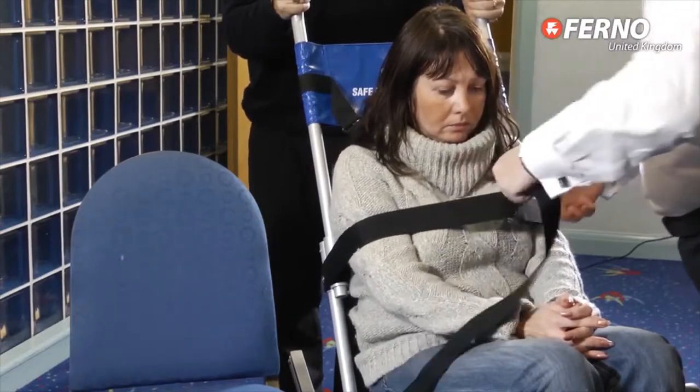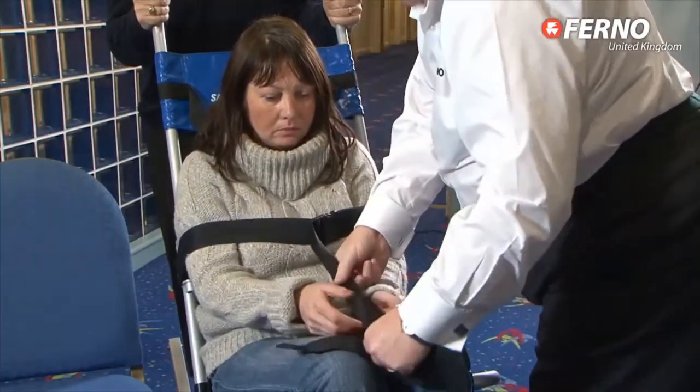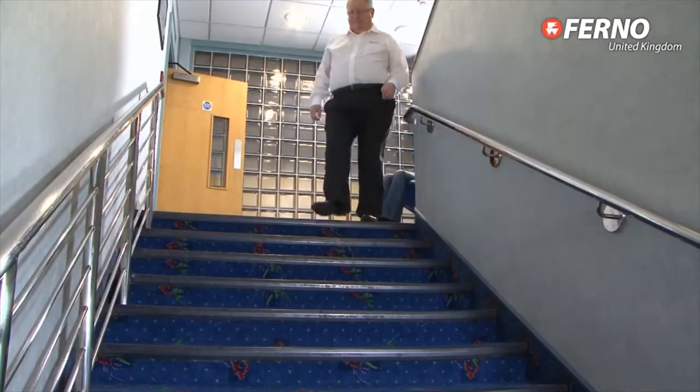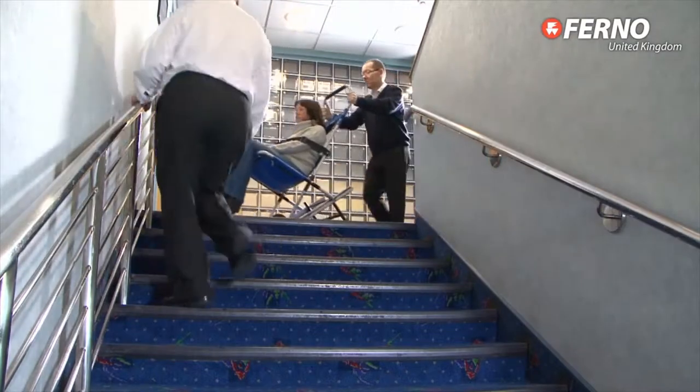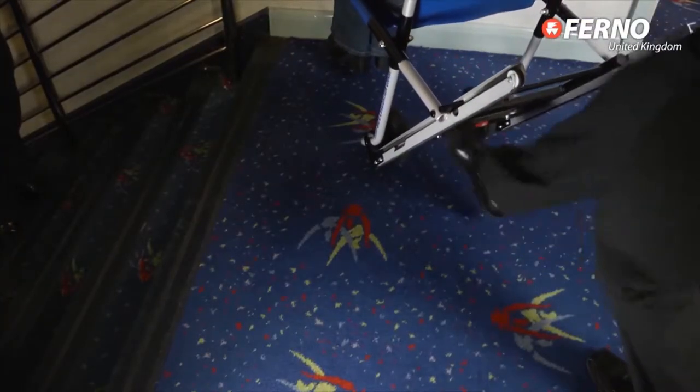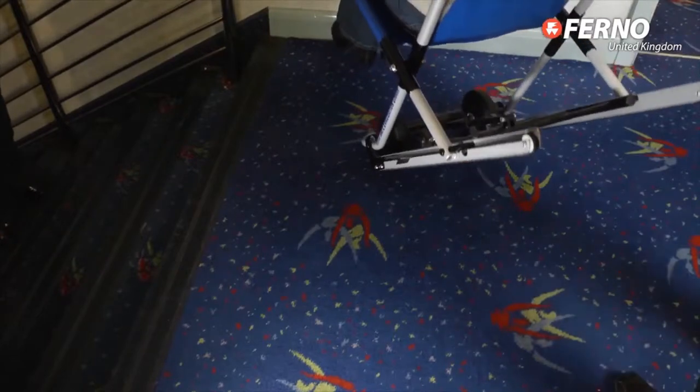Once the person who is being helped is safely strapped into the chair using the buckled chest restraint, they can be gently lowered down the stairs. Because the wheels are set inside the frame, it makes the chair suitable for even the narrowest stairways and capable of turning the tightest corners.